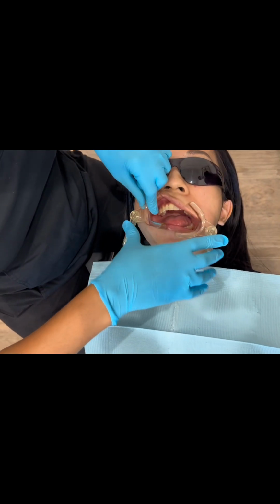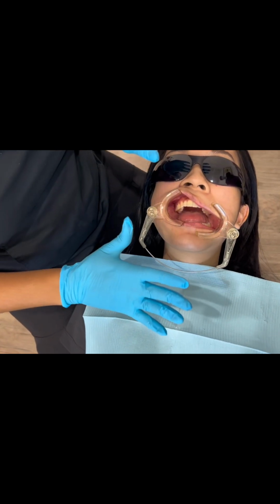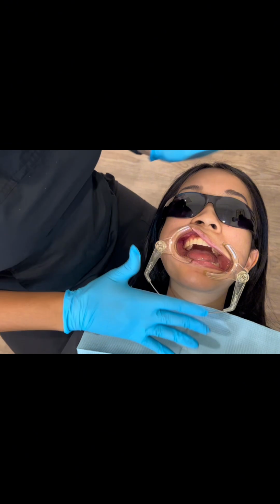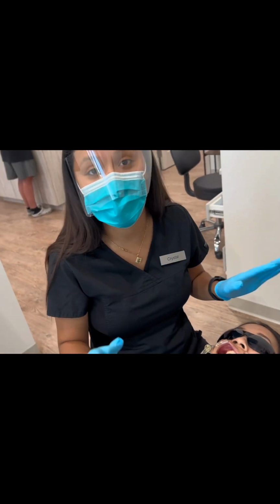And I'm gonna go ahead and get these cheek retractors in. Notice the flaps are the first things that go. A lot of people are nervous about putting these cheek retractors in. This patient is fine, okay? We are not performing surgery. Nothing here is a big deal, okay?